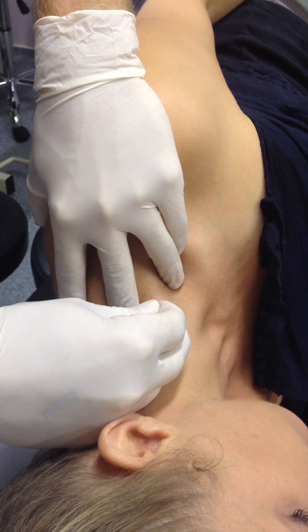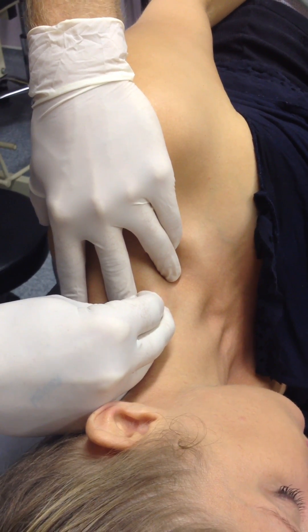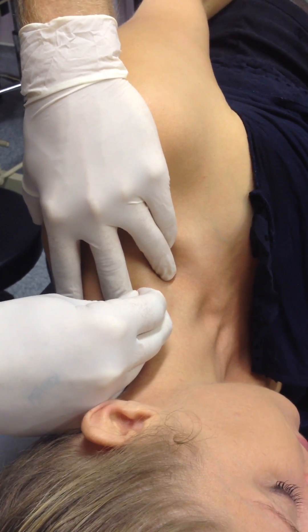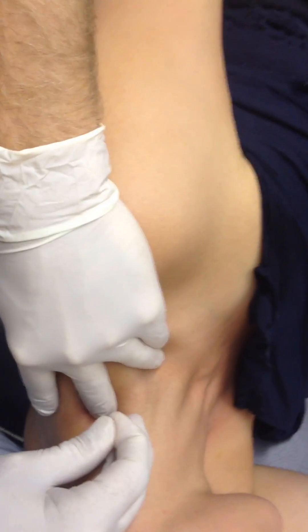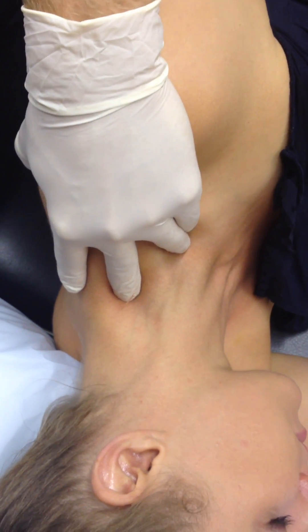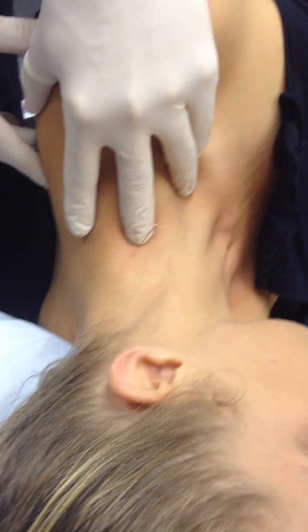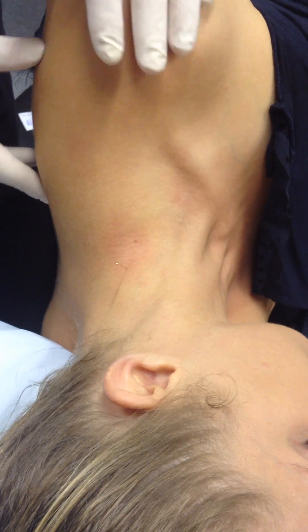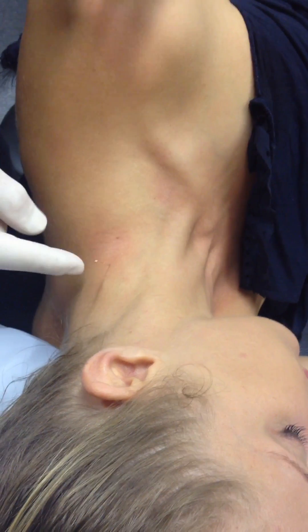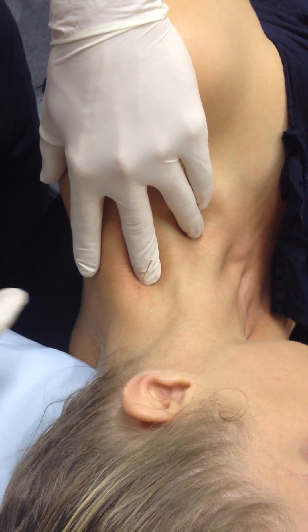So that's medially and posteriorly. We've got a nice twitch out of that. So once you've got that in — obviously the skin had been dragged so the skin's moved and that's changed the position of the needle, but it hasn't gone any further and it's sitting in the muscle so that positioning's fine. If you want to move it again though, make sure you pop that finger on and drag the muscle away and then you can move it again.